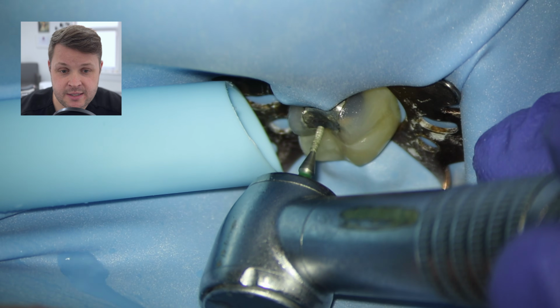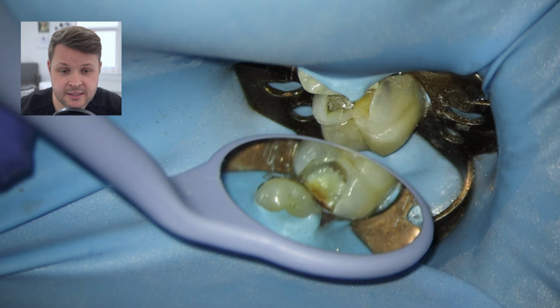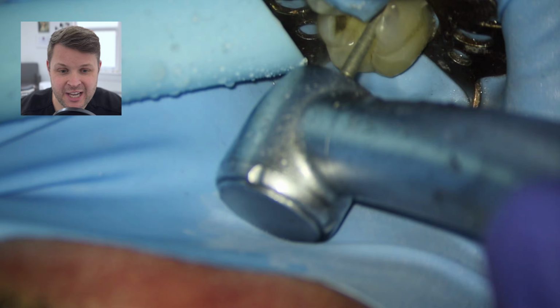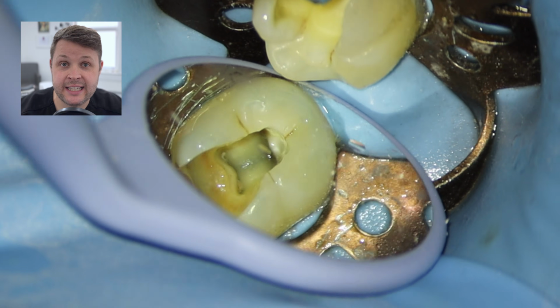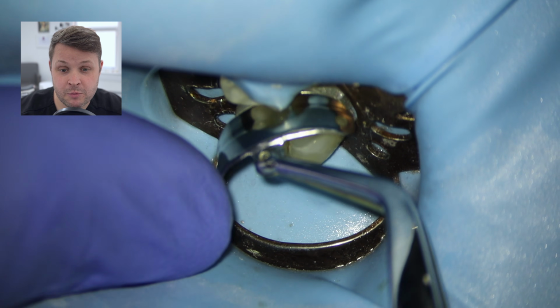So in the first instance, what I'm going to do here is remove these amalgam fillings, and essentially I just like to drill around the edges, and that undermines the filling, and this just popped out nicely, and then some of the decay is removed. And we can see now that the cavity is all nice and clear, but that distal margin is very, very close to the gum line.